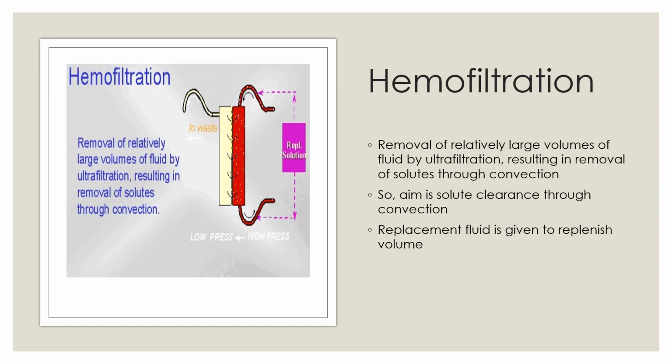Hemofiltration. It is removal of relatively large volume of fluid by ultrafiltration, resulting in removal of solutes through convection. So, aim is to clear the solute through convection. Replacement fluid is given to replenish lost volume.